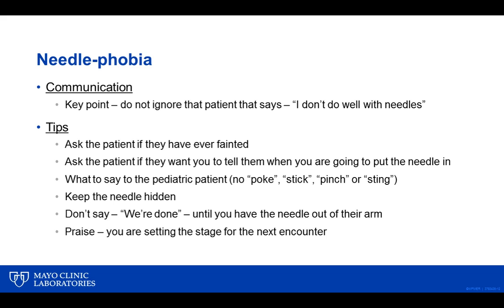But you've got to be looking at the safe side of it. When you're all done, it doesn't matter if it's peds, the elderly, or anybody else, tell them they did a great job. Praise them so they feel confident the next time they come in.